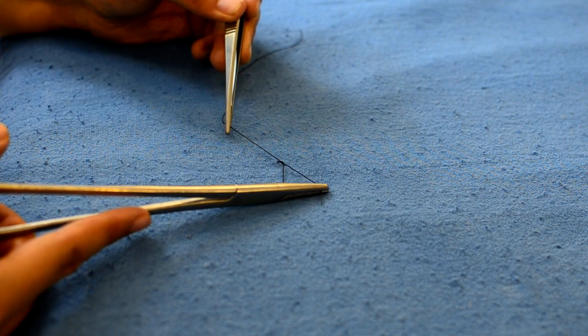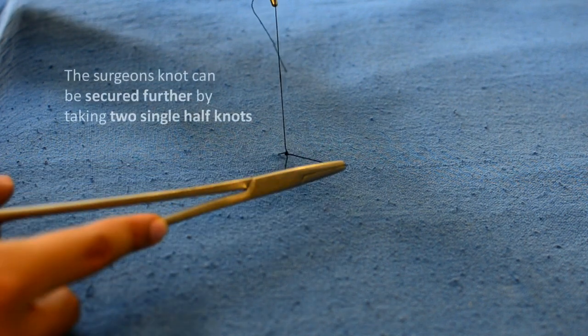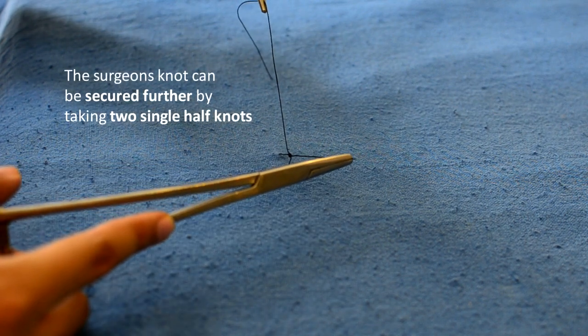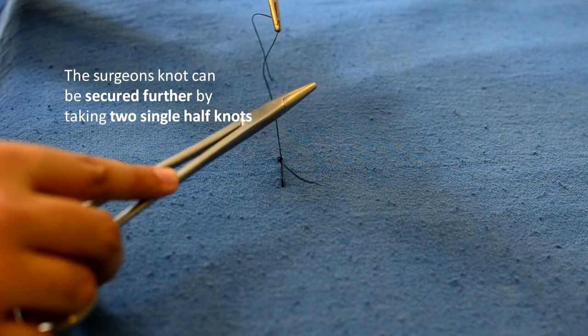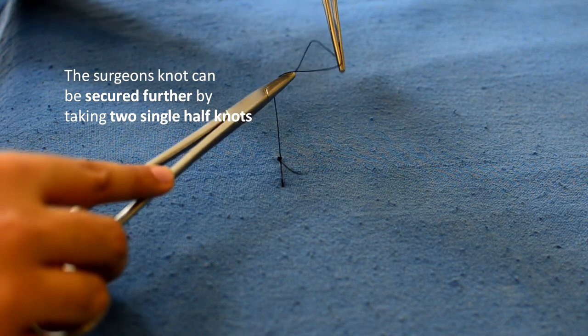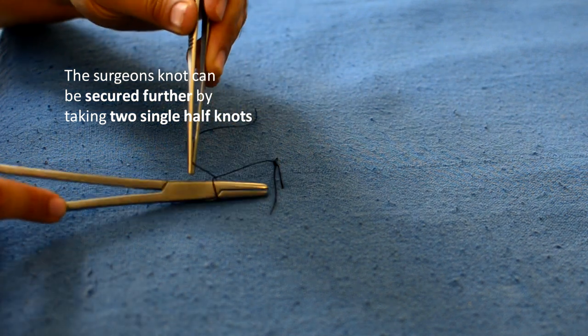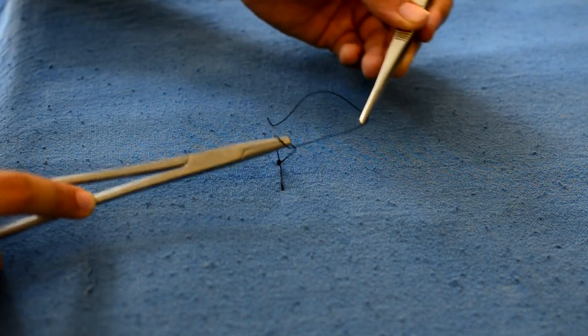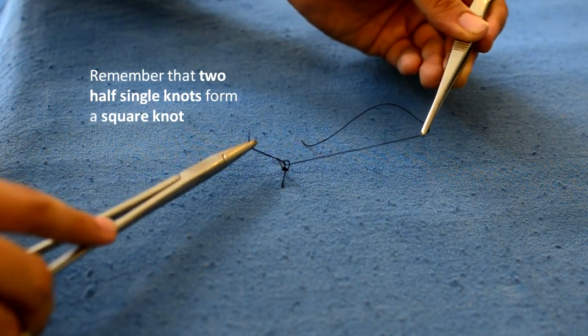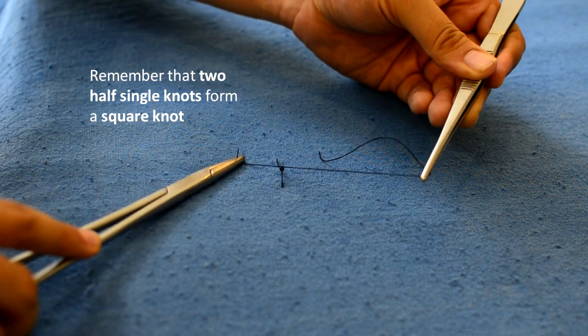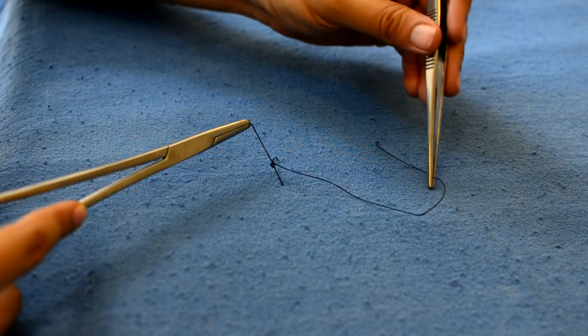This surgeon's knot can then be further secured by taking two half knots. Again here you have to recognize the V and the long and the short end of the suture. Remember that two single half knots will form a square knot whereas a double half knot in combination with a single half knot will form a surgeon's knot.